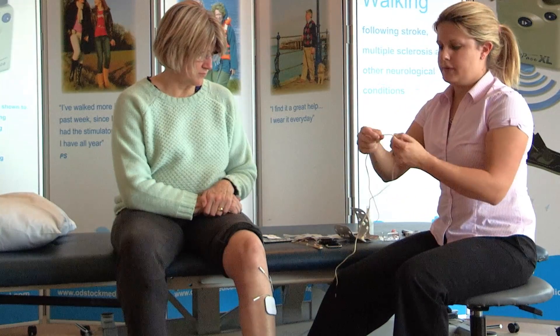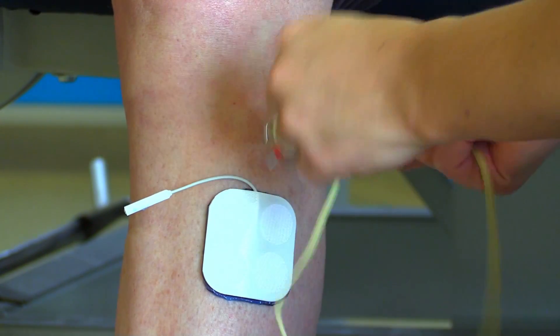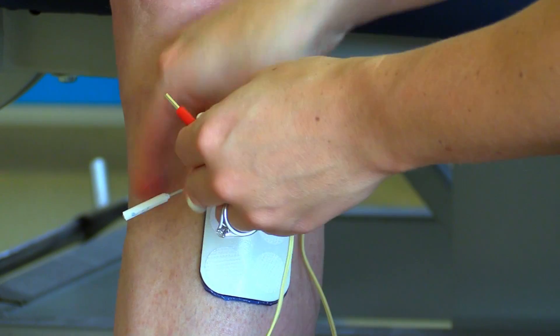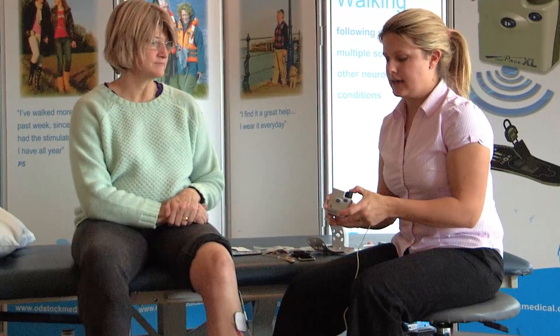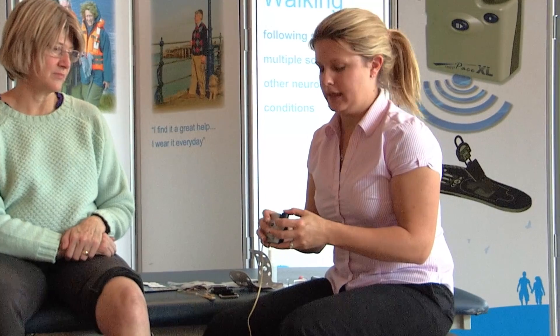Start off by taking a long electro lead. Plug in your black and red as required. Take the ODFS Pace or Pace XL, turn it on, and plug in the electro lead.